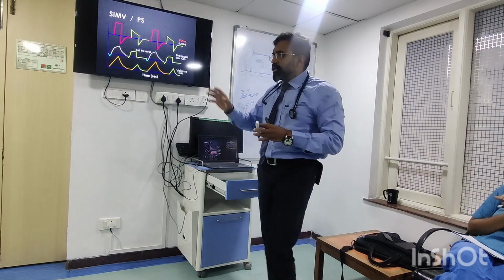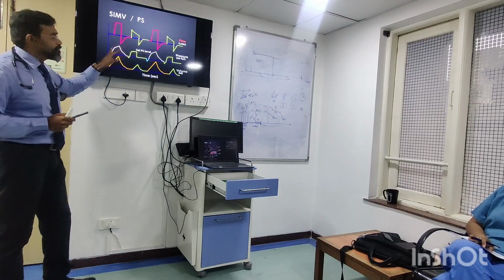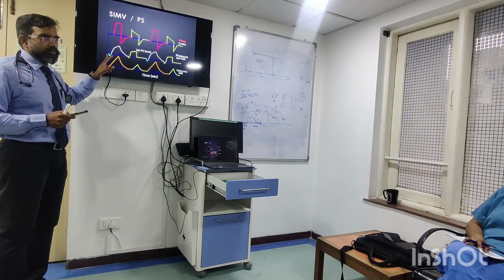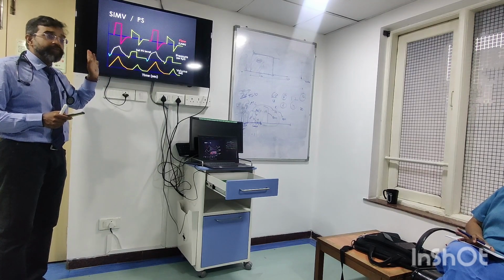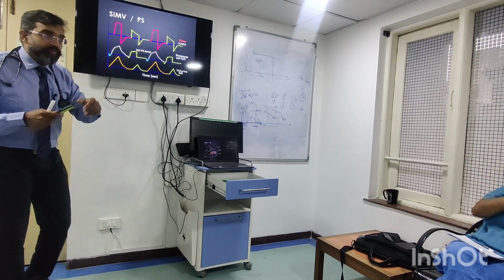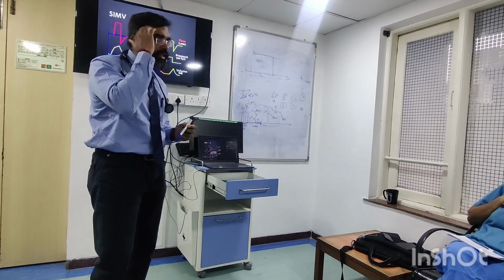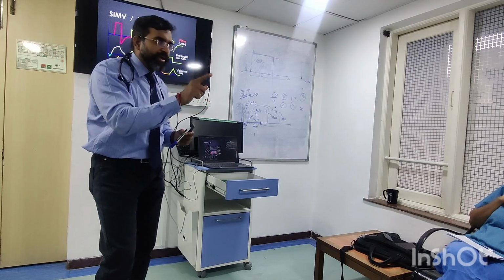Now what you must understand here, let's go back to this mandatory breath first. What is the trigger here, Nikhil? Mandatory breath. Machine trigger? No. What is the trigger? Why are you calling it machine trigger? Why is it patient trigger? Please, when you get the term, you can answer. Negative deflection. Pressure. Patient is initiating. Don't say negative pressure. Patient is initiating. Because otherwise, if you say negative pressure, now you will start searching for the negative pressure on the waveform. Patient is initiating. I have not said it.